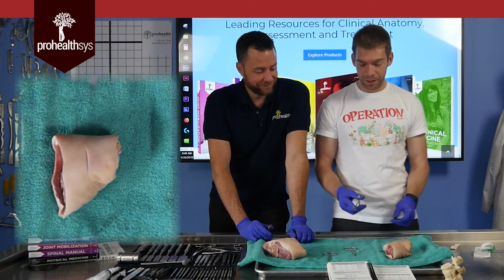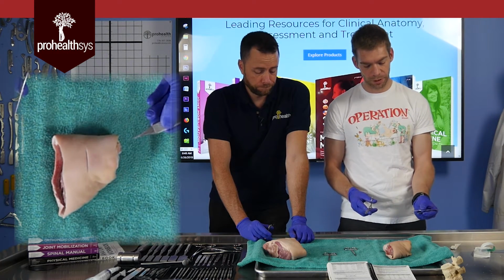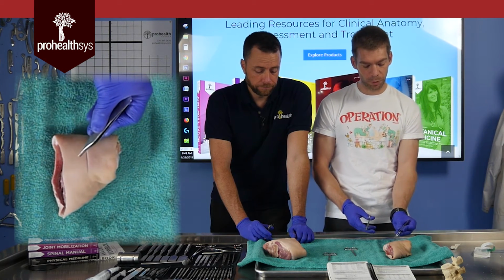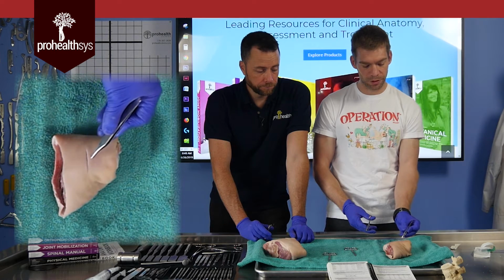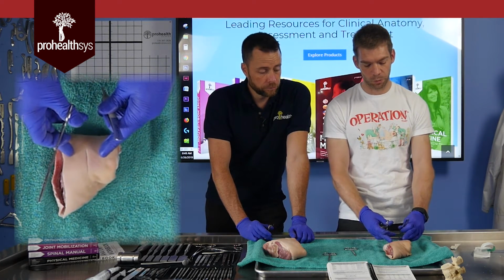Don't do that. Anyway, what I have here is my tooth forceps for handling the skin, and the first throw that I put in, and I'll only do one throw for this video, will be across the center. Why across the center? Why not at the end? If you do it across the center, you can make sure that the wound is lined up.